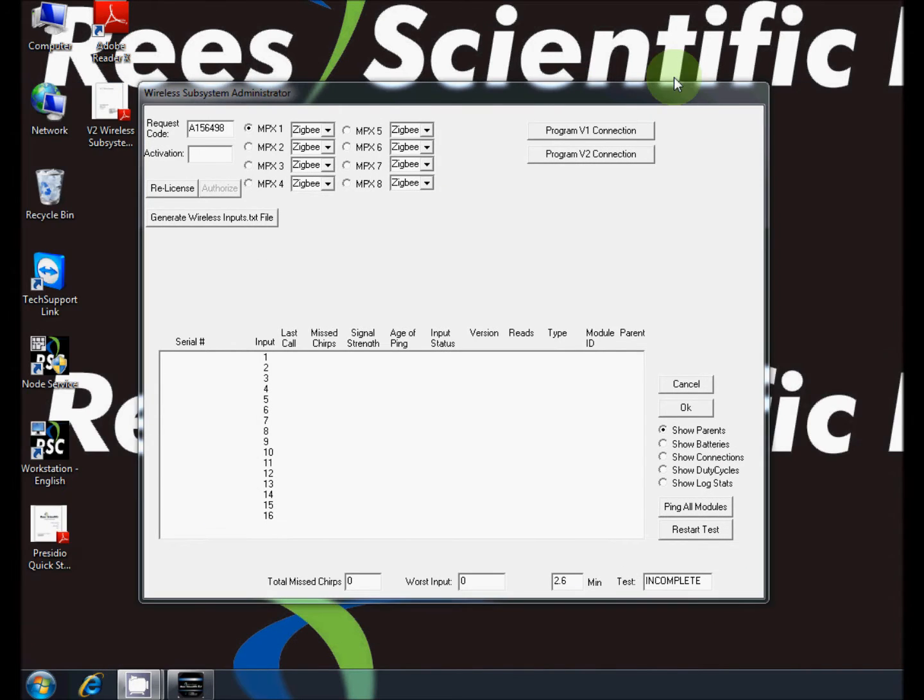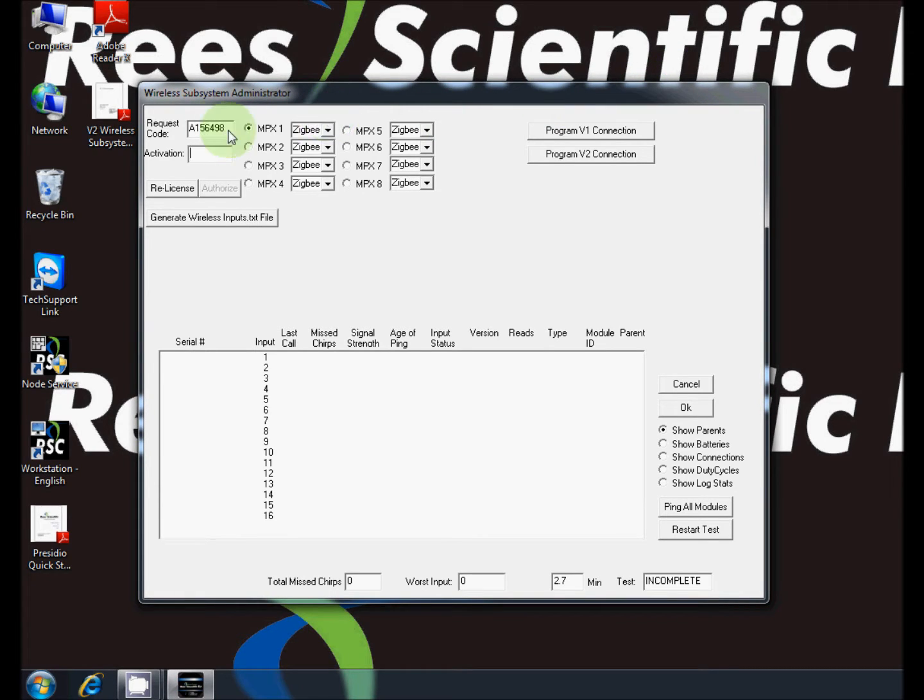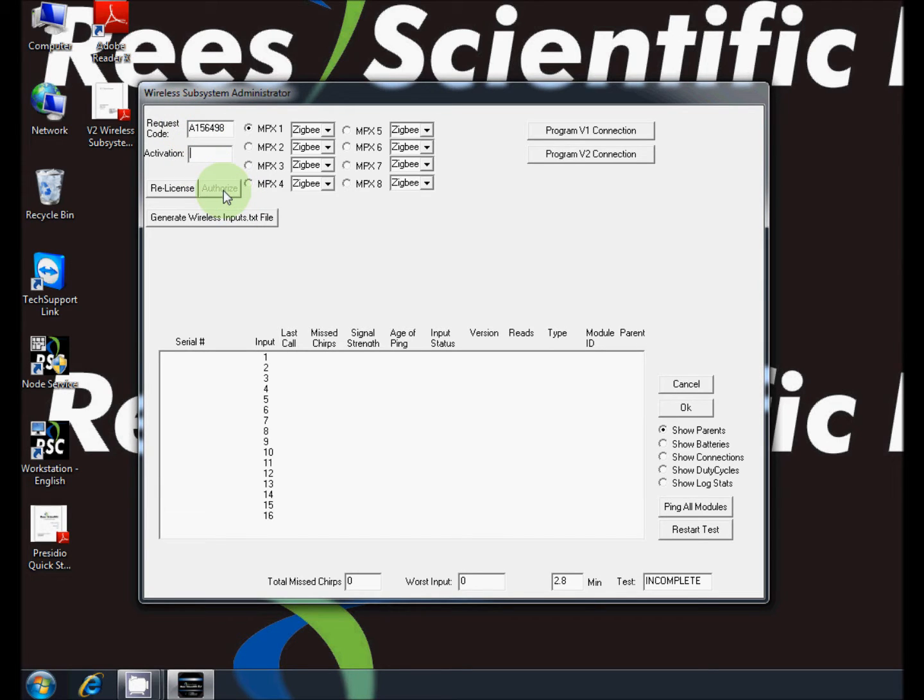To use this program you will need an activation code which can be obtained from the ReScientific website using the request code given. In the event that you cannot obtain an authorization code, contact tech support for assistance. Place the code in the activation box and press authorize.